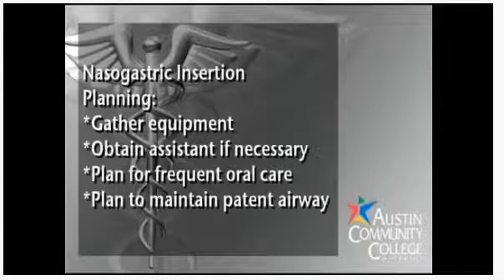During the planning phase, we will gather our equipment, obtain assistance if necessary, plan for frequent oral care, and plan to maintain a patent airway.